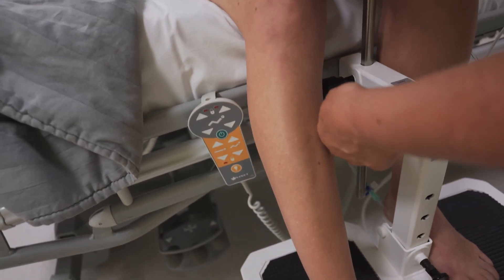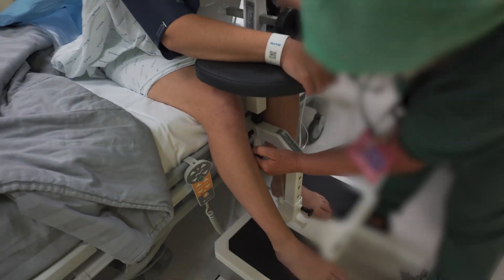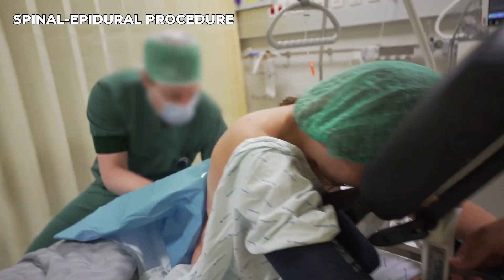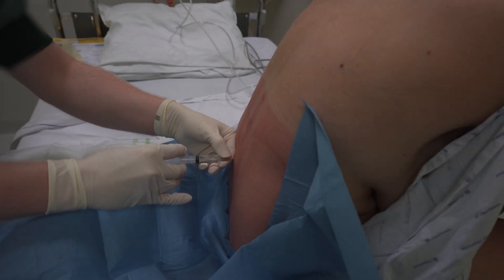To adjust the height for individual patients, go up. Now we adjust the height. These are quick adjustments. Here's the position now — you can see it's near ideal position for this study.